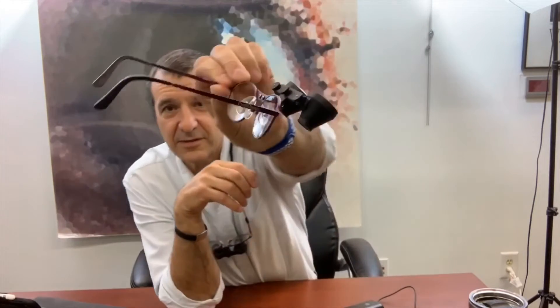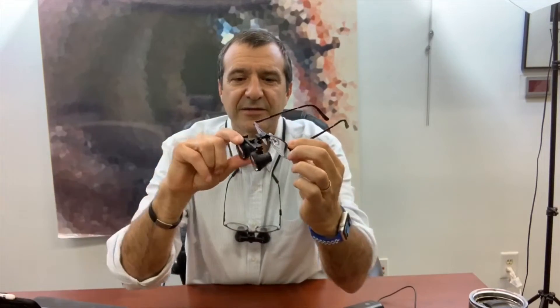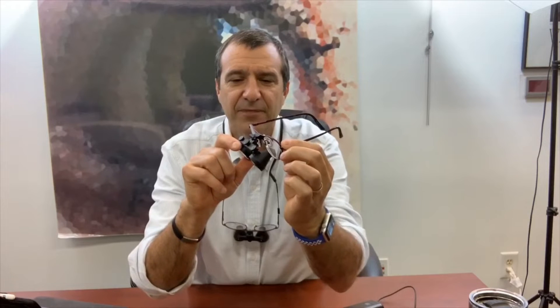I'm going to do a quick summary. We have a set of glasses with titanium frames. We install your prescription — whatever that is. If you wear progressive lenses, we install that as a bifocal and distance. It's going to look like this: little bifocal high-resolution magnifying telescopes are attached to the frame.